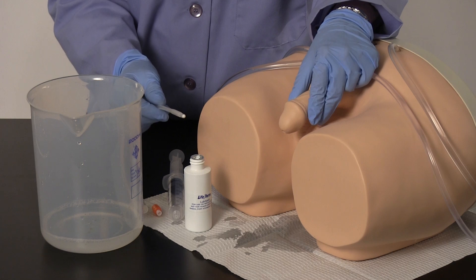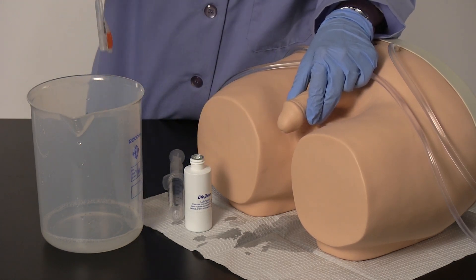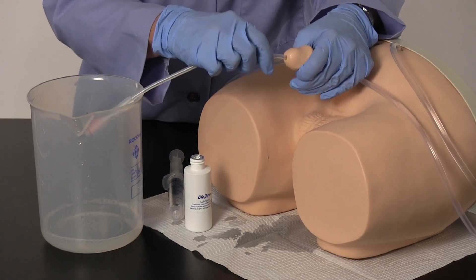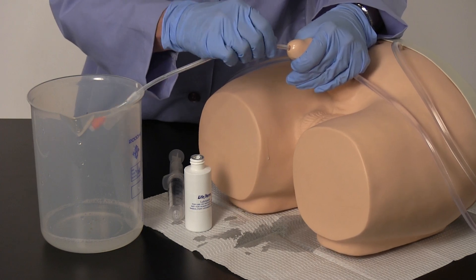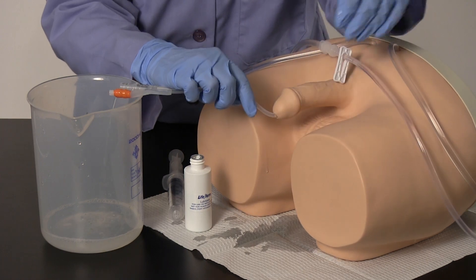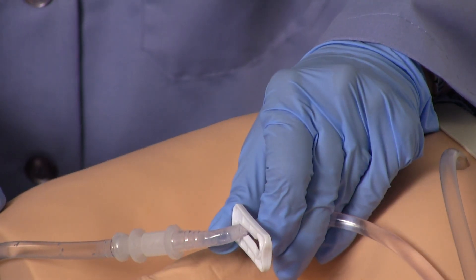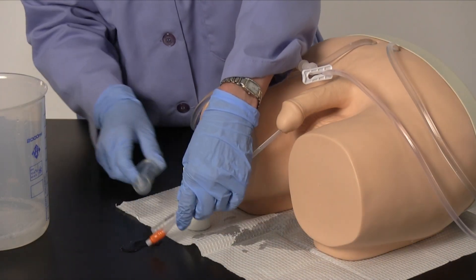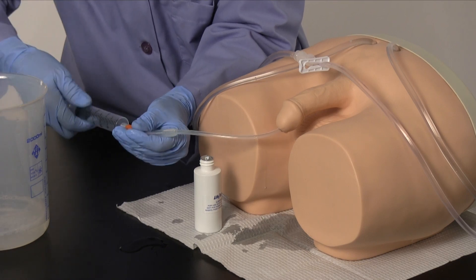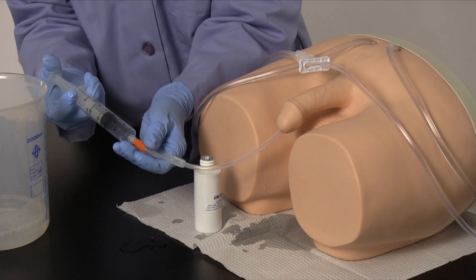A 20 cc syringe will be needed for this procedure. The syringe shown is not supplied. Follow the procedures before performing a catheterization. To restrict the flow of water when inflating the cuff, slide the clamp closed on the fluid administration set. Connect the 20 cc syringe to the threaded end of the catheter, ensuring the syringe is pulled back and filled with air. Depress approximately 10 cc of air into the catheter to fill the cuff.